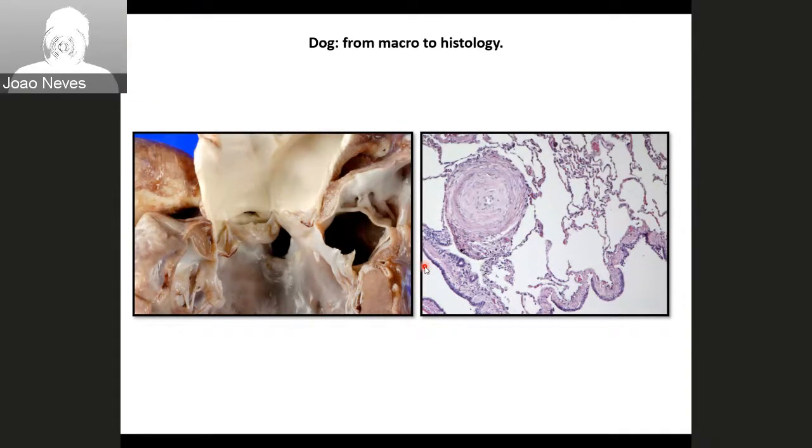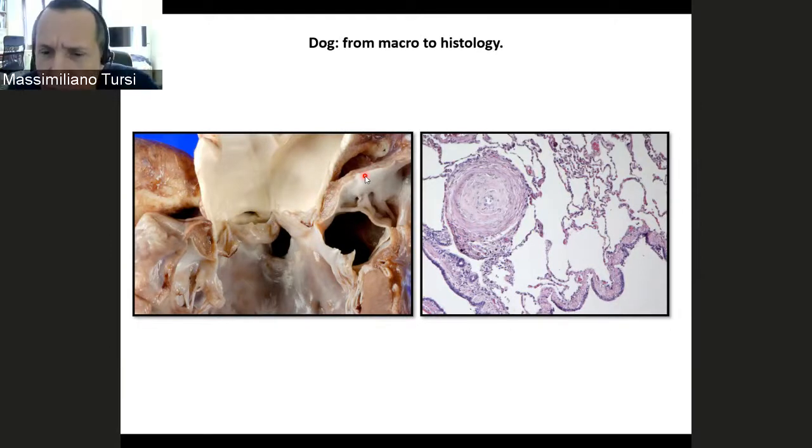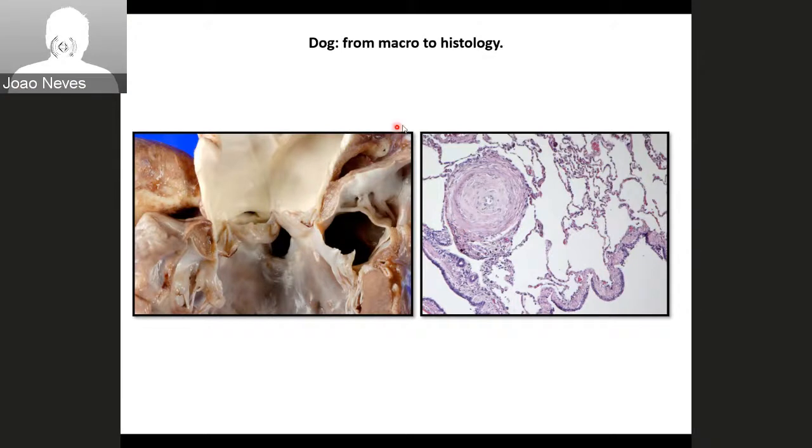Massimiliano, can I ask you a question? On that artery, if I was in an exam situation, I would definitely say medial, and I would say also intimal, because I know the intima also gets thickened. But can you really differentiate between the intima and the medial layer on that picture, or is it impossible to differentiate both layers? It's not so easy. The muscular layer is quite thin, much thinner, isn't it?